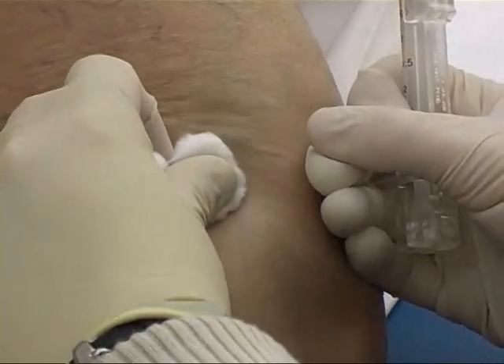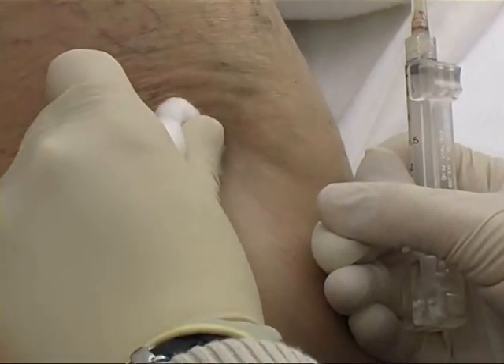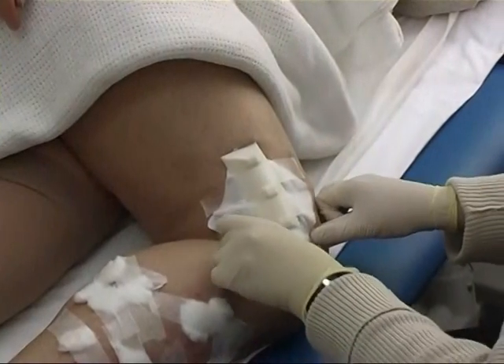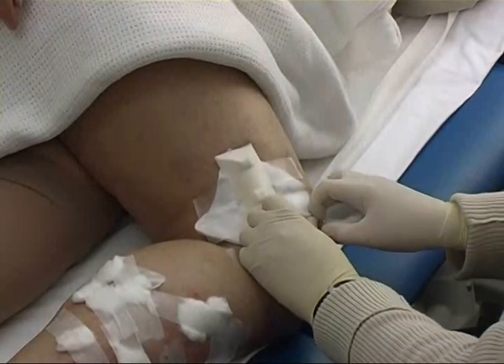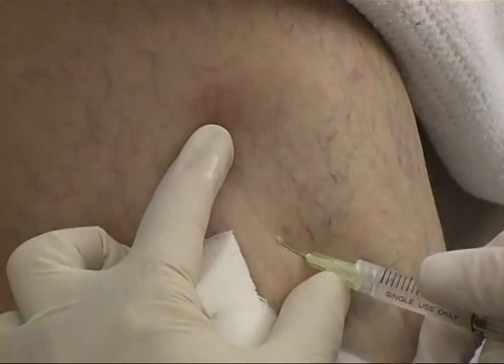Finally, the skin is massaged to ensure that the sclerosant is distributed to as many small veins as possible. A compression pad is then applied to the skin, which will be worn beneath the stocking.